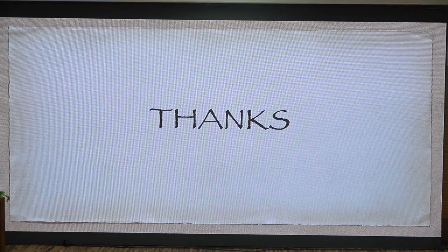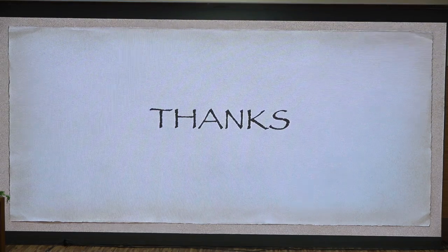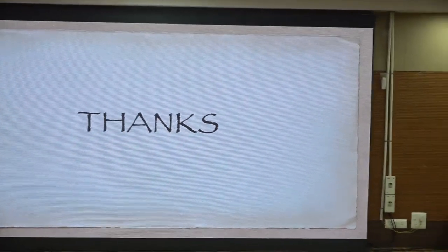So basically, we use topography mainly for two purposes. One is the diagnosis of keratoconus or abnormal elevations, like sometimes you get patients of pellucid marginal degeneration and post-LASIK ectasia. That has also become very important these days. The patient has undergone LASIK and then suddenly presents with ectasia. So it is important from that point of view also.